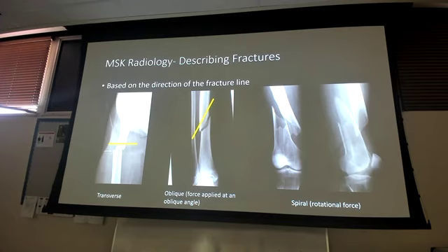There's a couple that are PA, like the wrist, which is just easier to lay like this, and the chest. But what I wanted to share is that regardless of how it is shot, like we talked about with the dislocations, we had to find a way to describe it so we all talk the same language. Same thing with this: regardless of how these pictures are shot, AP, PA, anything along those lines, they are always going to flip those images so that your right is their left and your left is their right, because that is the standard expectation across medicine, okay?